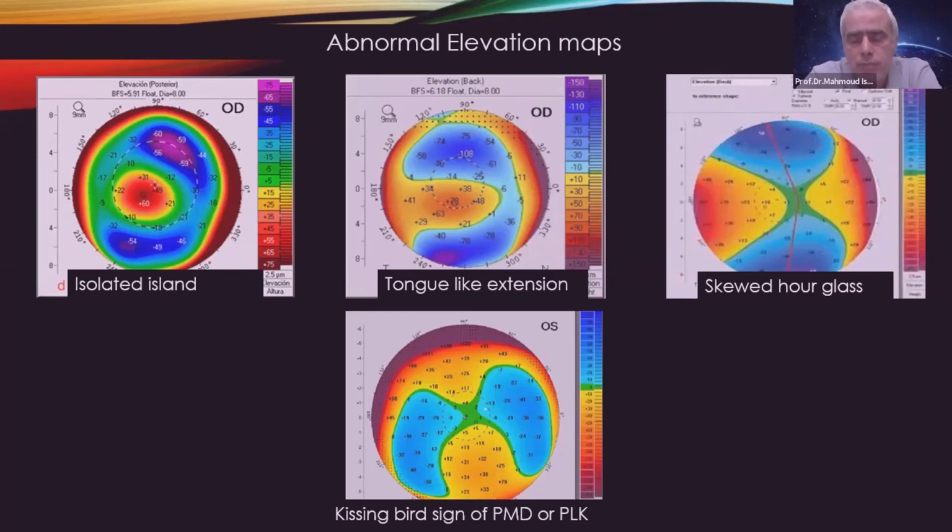A lot of them have faint opacities or pannus in one way or another that develop abnormal corneas. So they look like rare corneas with bizarre topography, or they have higher order aberrations not coinciding with the map that you have. In these cases, you just look carefully at the cornea. You will probably find your answer clinically examining in the slit lamp.